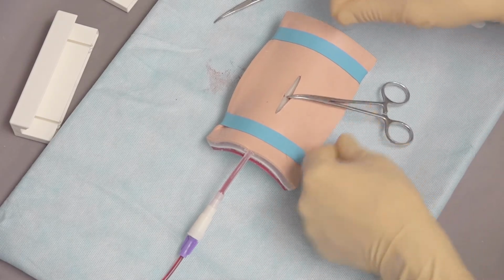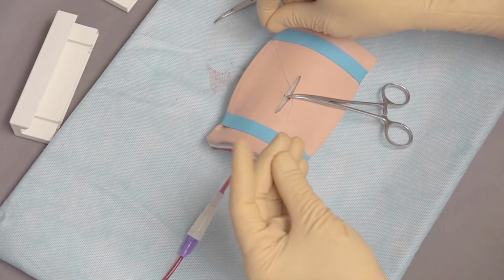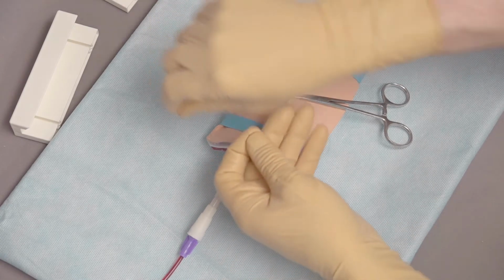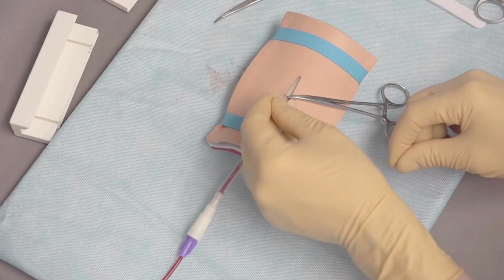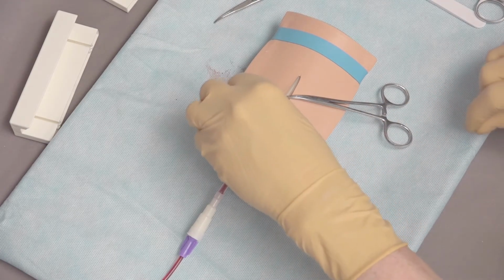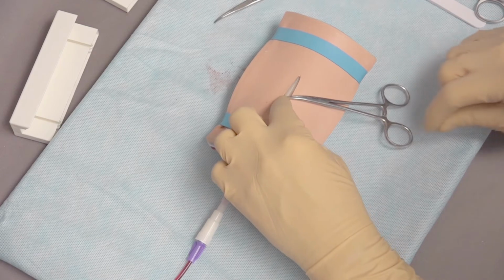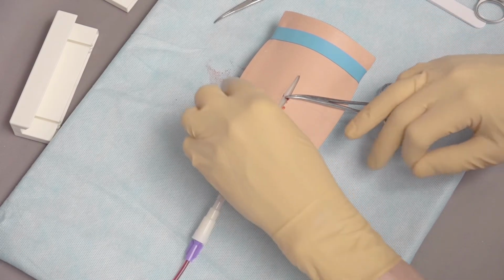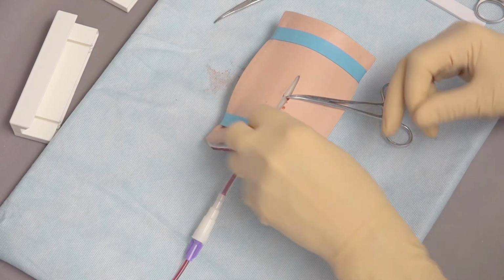Now we're going to use the other side, coming in again, using a one-handed hand tie. The key is to make sure the end of the suture goes around the end of the hemostat and around the vessel, not including the hemostat.